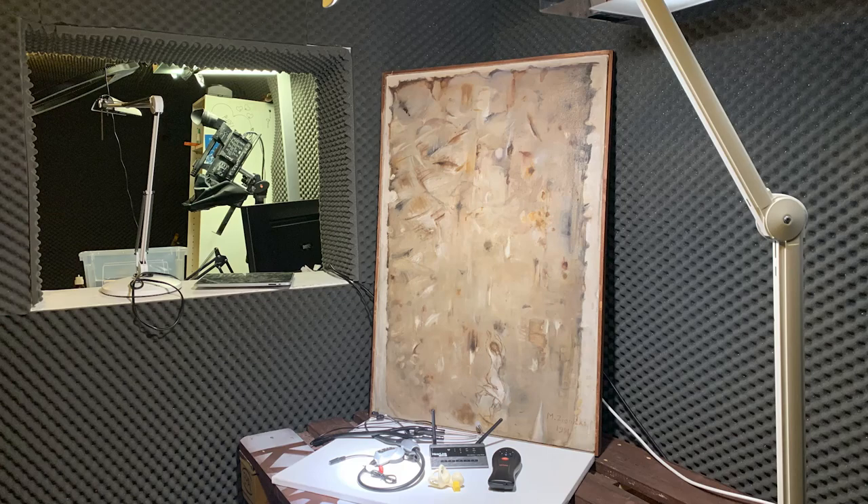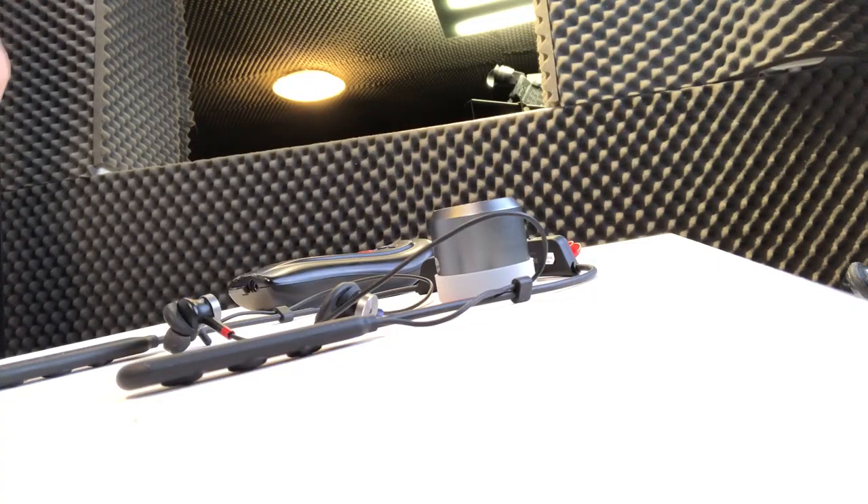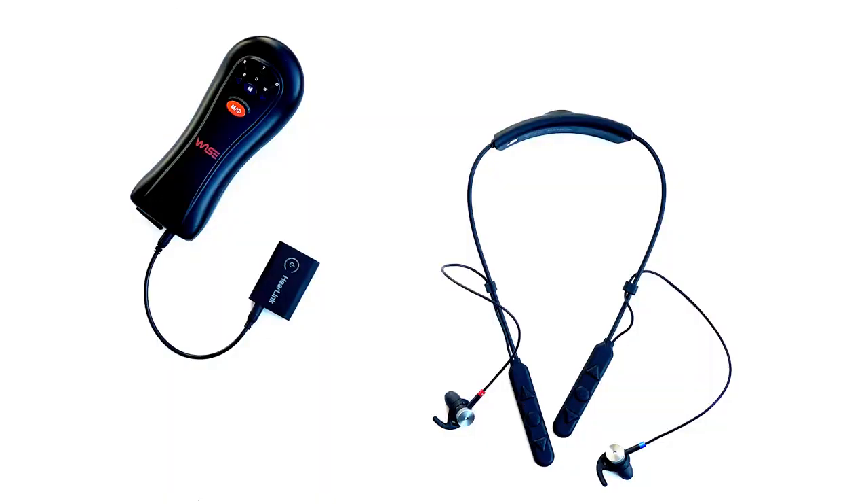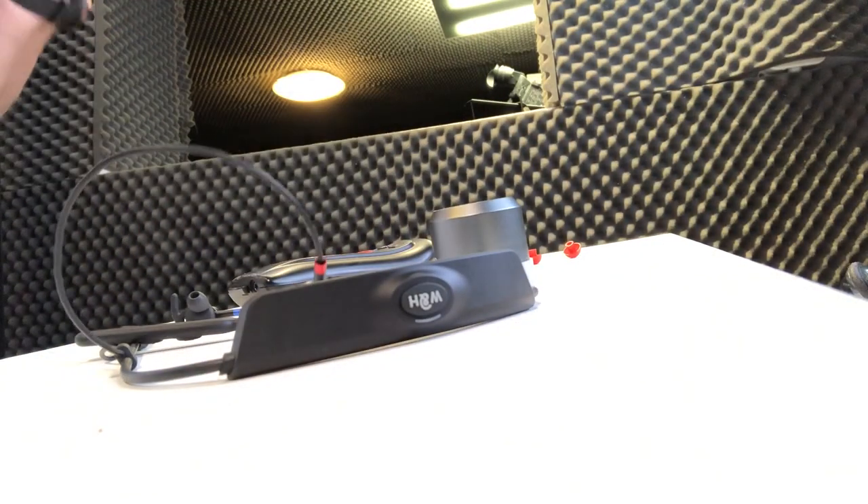Today we're talking about digital stethoscopes and how to connect them with the Bluetooth hearing amplifier. It's hard to present a new product, but this is an extremely interesting product designed for people who do not like, for whatever reason, to wear hearing aids. They are very well designed with the ear tips. Today, I will connect a digital stethoscope like this one to the headphone system.